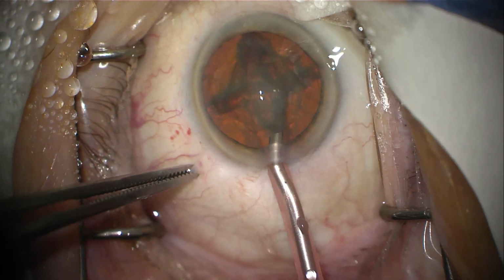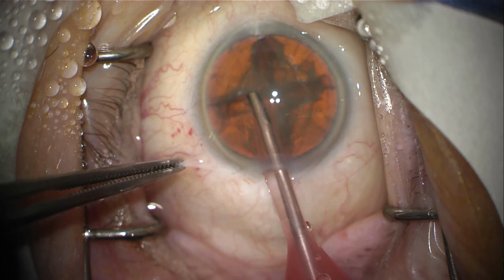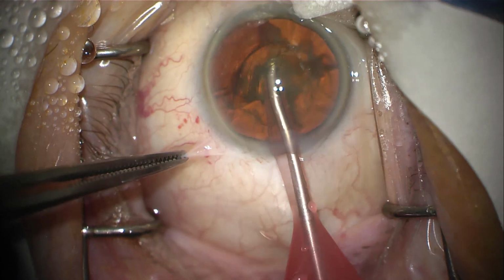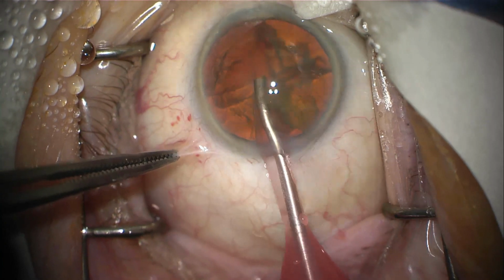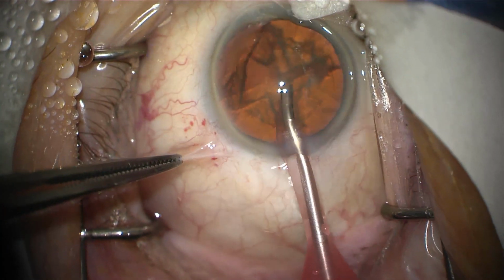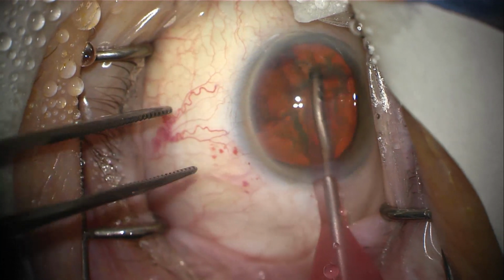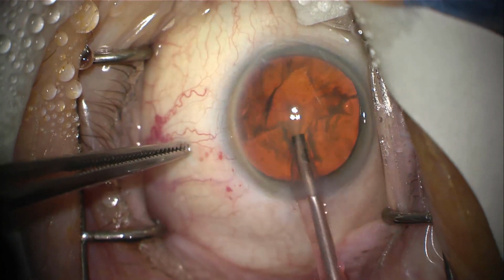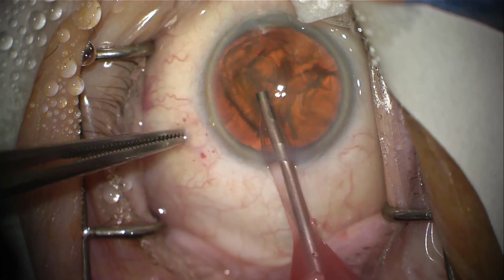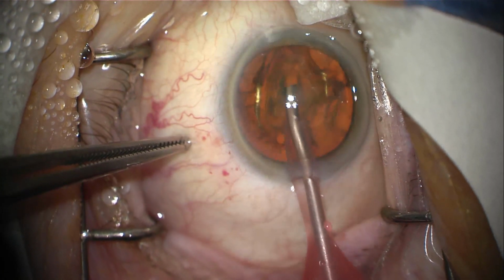I then reinsert the phacoemulsification device, and now I can take out these individual chunks or quadrants of the cataract with this phacoemulsification, which liquefies the cataract with vibrations and simultaneously vacuums it out of the eye. I rotate each of those quadrants so that I can access them.